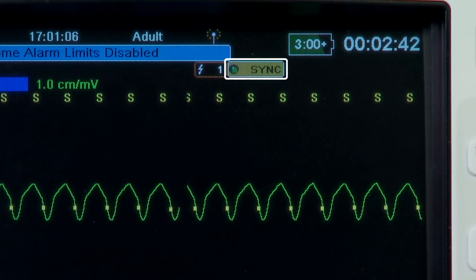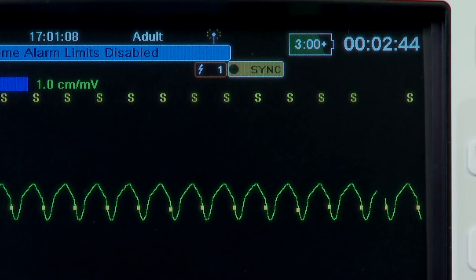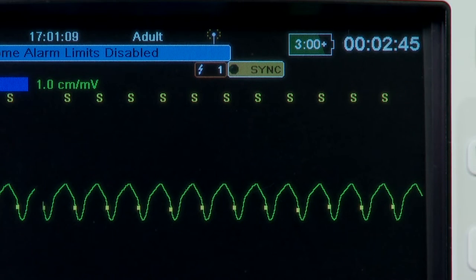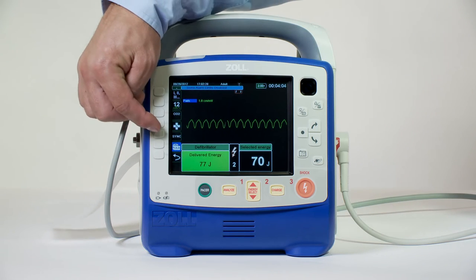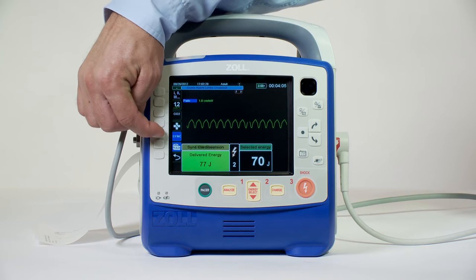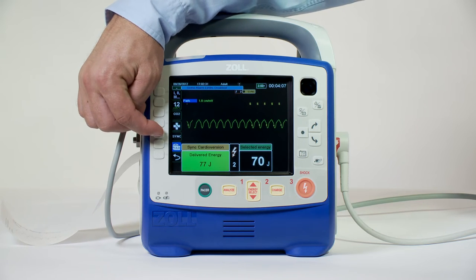Unless otherwise configured, the unit automatically exits sync mode after each shock. To reactivate sync mode, press the sync button again on the front panel.